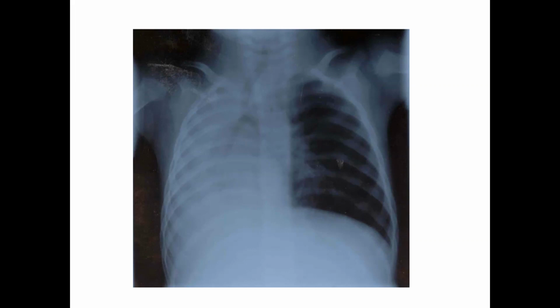But with the chest X-ray, you've got the posterior anterior film that's typically done in the hospital, or in the radiology department rather. It is the superior film in regard to the AP film, your anterior posterior film. The AP film is done on a portable machine. Not all patients can be transported down to the radiology department for a PA film, so AP films are done. You just have to understand with an AP film that your heart is likely going to be a little bit more magnified because it sits closer to the X-ray source.